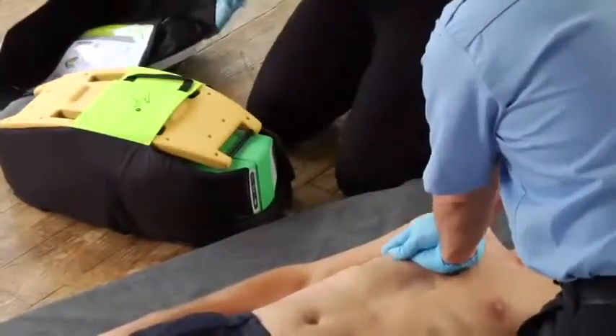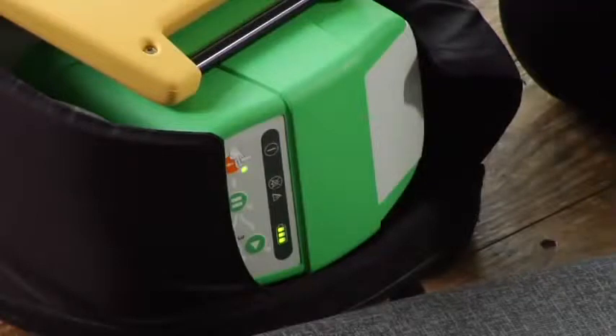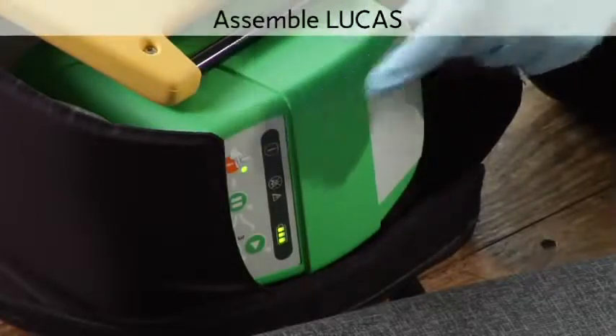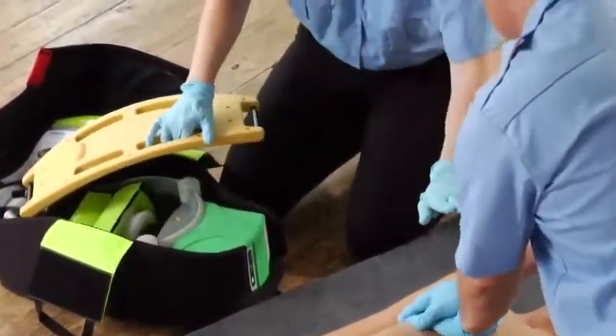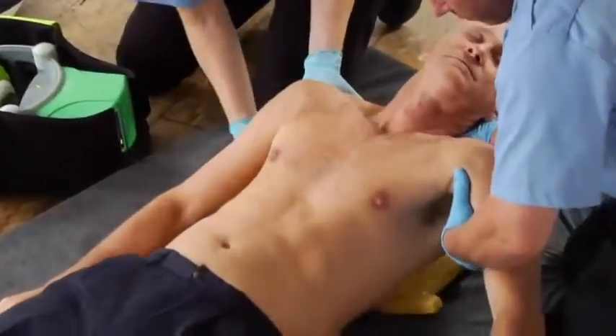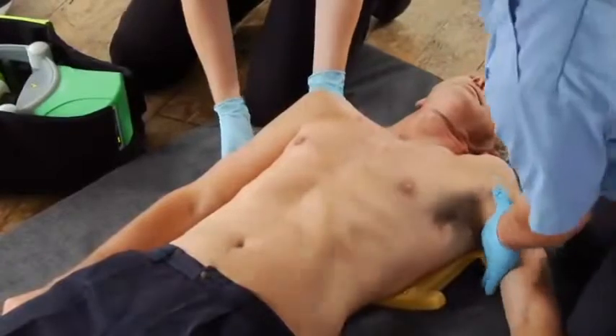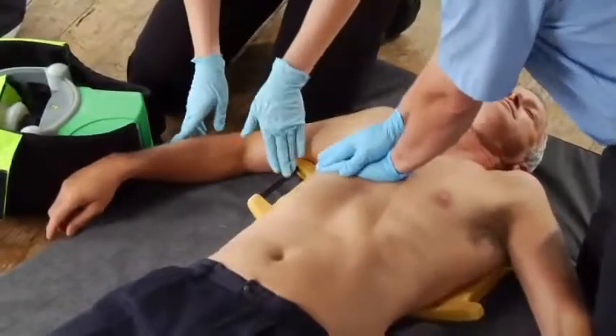Before you take Lucas out of the bag, push and hold the on-off button until it turns on. It self-tests, and you see the green LED when it's ready to use. Get out the back plate, stop compressions briefly, and slide it under the patient's back. If there are only two of you, one should support the head while both of you lift the upper body. Lay the back plate below the armpits. Clear the patient's arms away from the back plate at the latch points. Keep doing manual chest compressions as much as possible — we're trying to keep up the coronary perfusion pressure. Clean off any gel or anything slippery from the patient's chest to help Lucas stay in position.